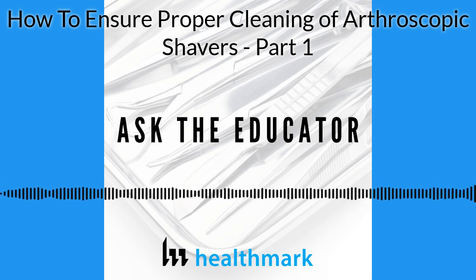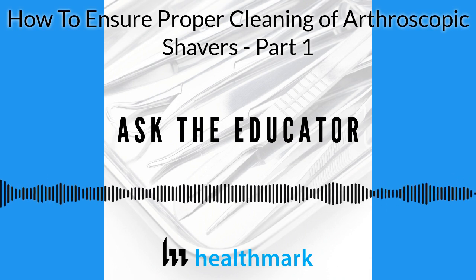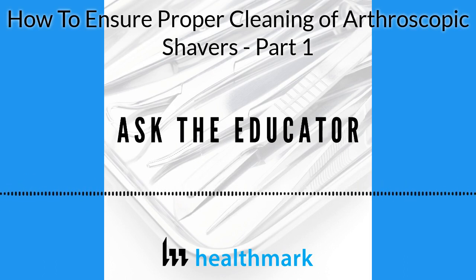And we know people were doing that at the very beginning, but you need a borescope or an inspection scope with a diameter to go look inside, but you also need magnification on the outside to look if there's anything. Your eyes can't pick up everything. So you need a couple different tools to do it properly. But there are departments, we've done surveys in the past, where there's still over 30% of departments that don't have adequate visual inspection tools, whether it's a handheld for the external or one of those boom magnifying glasses, Kevin? The desk-mounted lighted magnifier, yeah. Yeah, and that should be at every workstation. And then you have a borescope to look into it.